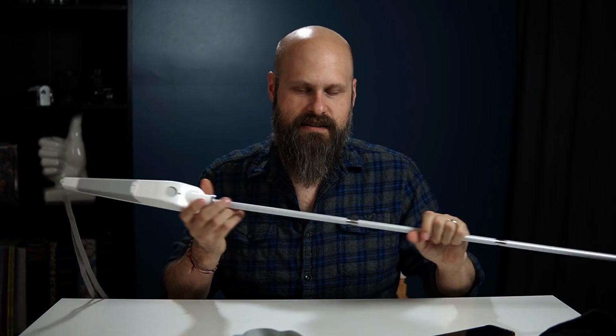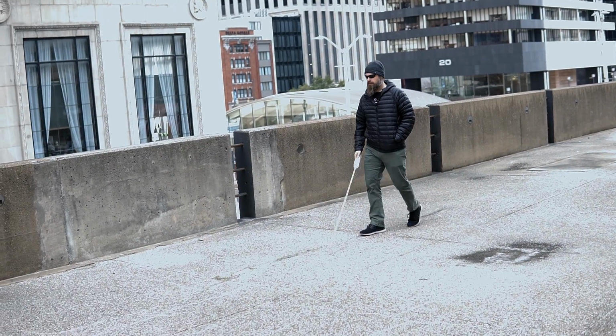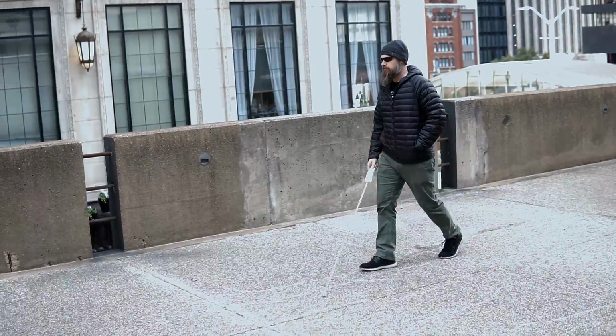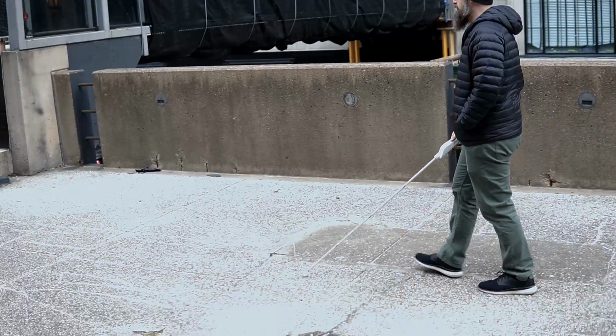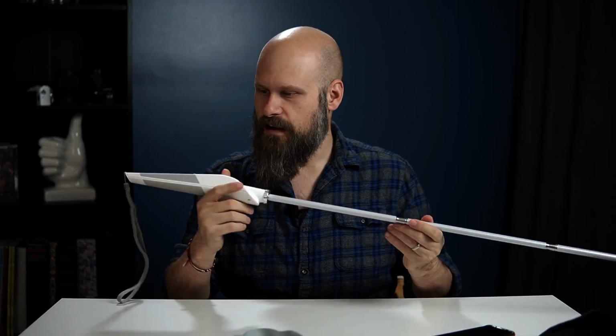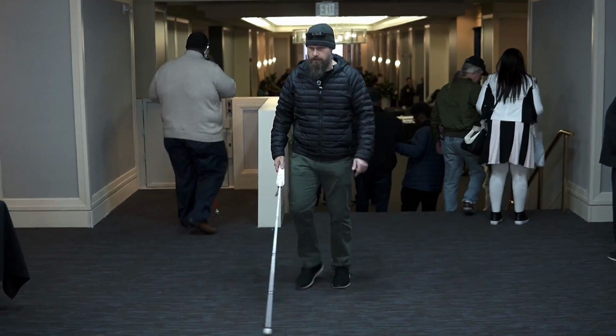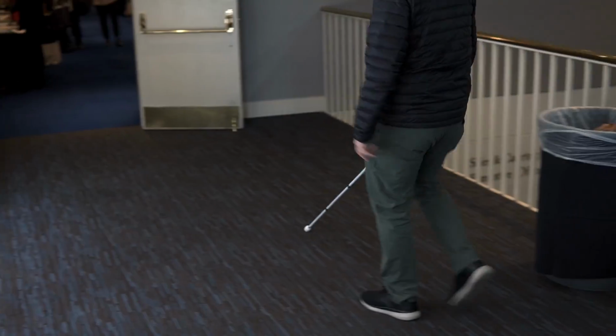The sound comes out of the cane, but if you're in a busy city, urban environment, are you going to be able to hear that sound? The other thing I could see being an issue is the size. It's a pretty chunky cane, and I can really see there being some wrist strain on this, some fatigue carrying this thing around all day long. If you're a cane user that holds their cane like a pencil, this is not going to work for you. This thing is way too big. You really need to be an overhand grip cane user for this to work.